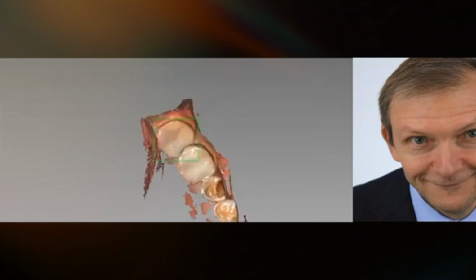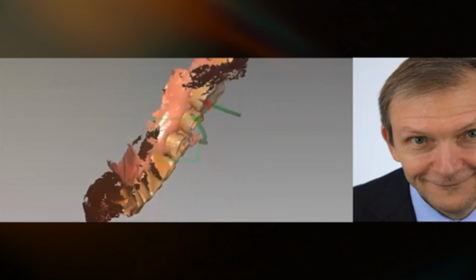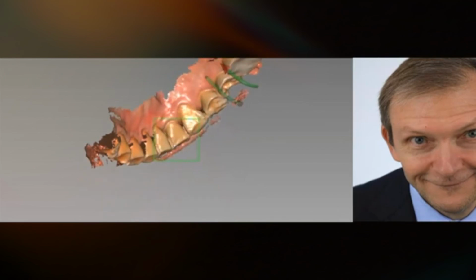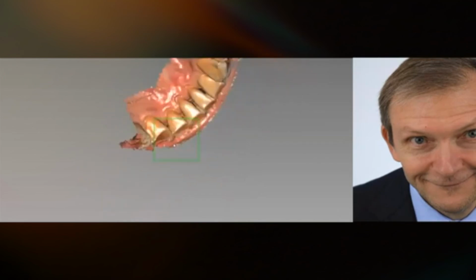As you can see, there are no preparations. Mandibular scanning.